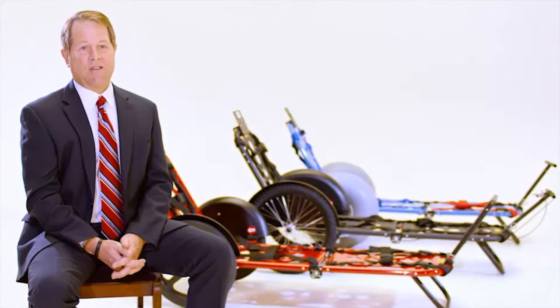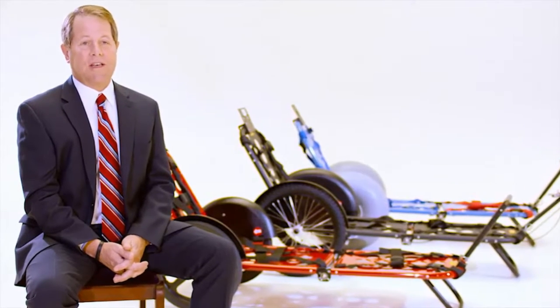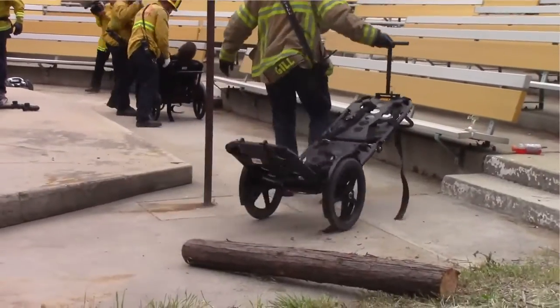Hi, I'm Jeff Parr, Media Director of Rex EMS, and I'm here to speak to you about the Rex Mobile Stretcher. Thanks a lot for taking a few minutes to learn about how the Rex Mobile Stretcher allows first responders to get to the injured quickly and efficiently.